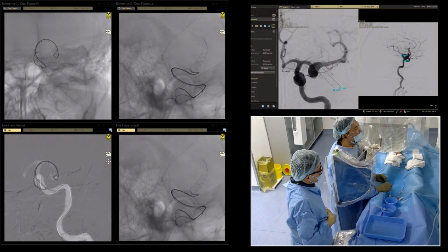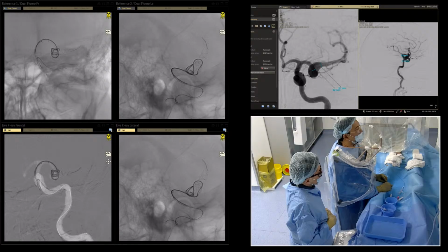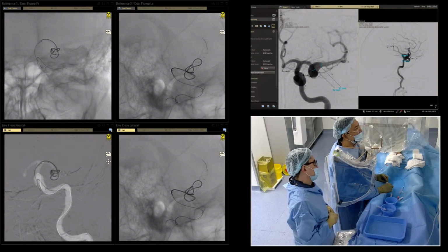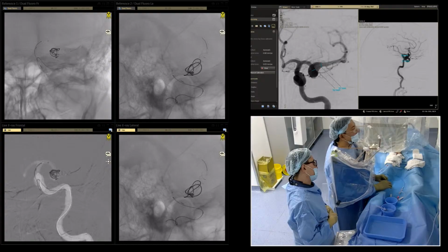I tried to bring the catheter. It's placed. It's pulled the whole system on. Okay, the point number 2, there is no marker.